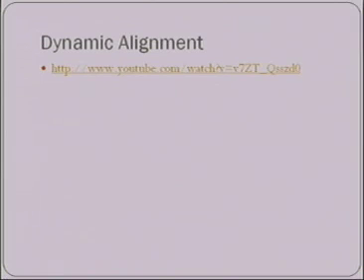That's all the different values you have to set for your basic bench alignment. This video is kind of short, but it goes through the steps of bench alignment, dynamic alignment, and then fitting of the final prosthesis. It goes through very, very quickly, so I'd suggest that you do go ahead and view the longer version that's more detailed on your Blackboard account.